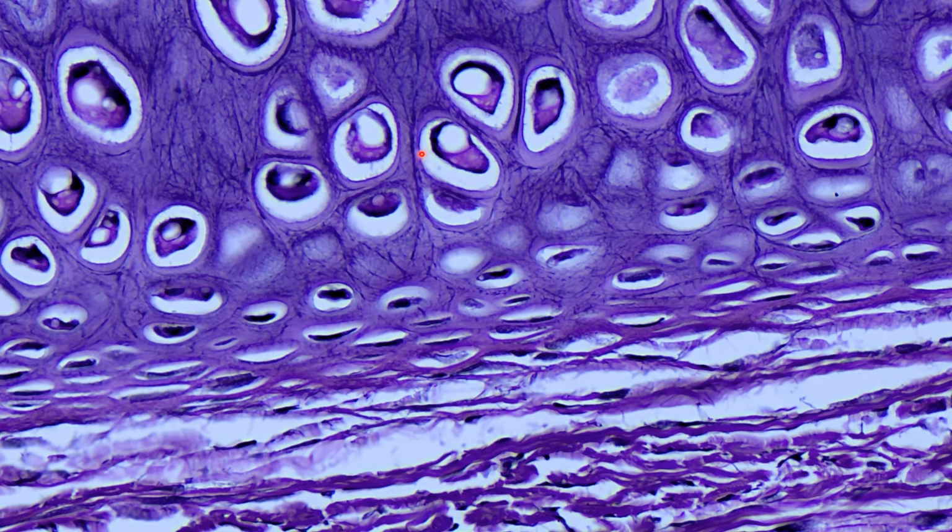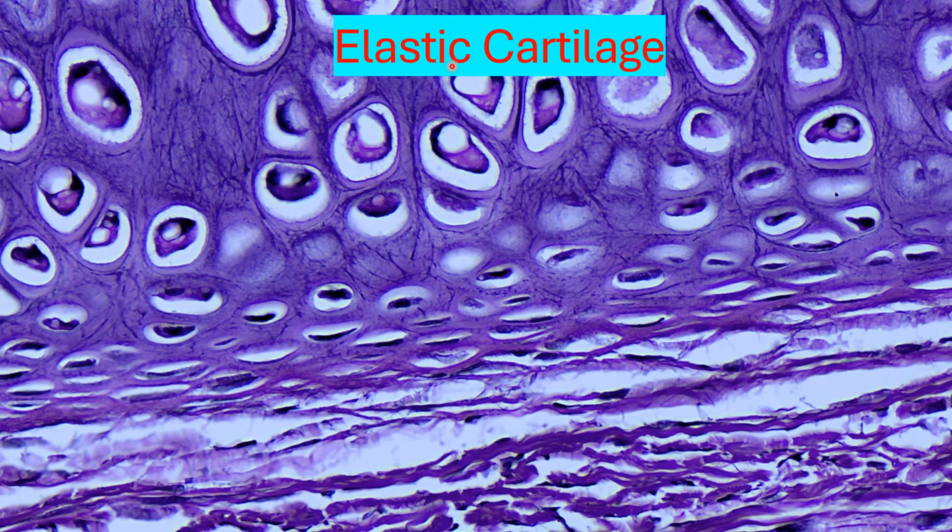So here we see some spaces, that's this white part right here, and inside it we have cells that live within them. The space is the lacuna, and the cell inside of it is a chondrocyte. Surrounding it is their extracellular matrix, it's a specialized type. This is a type of cartilage. This is elastic cartilage.